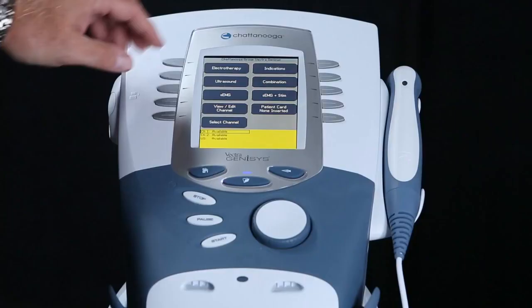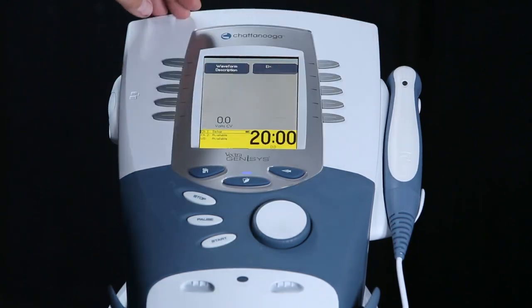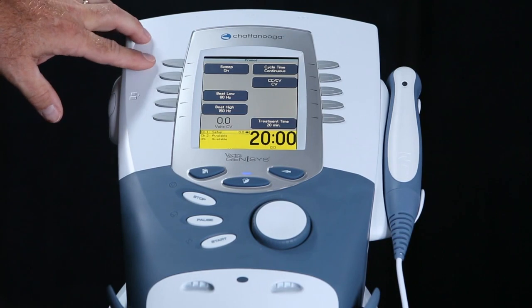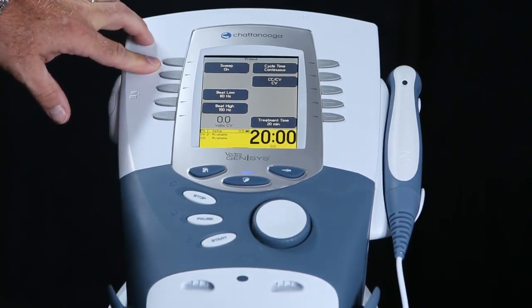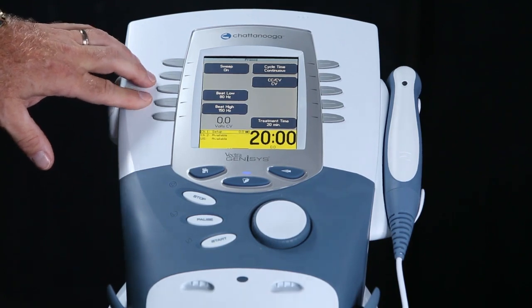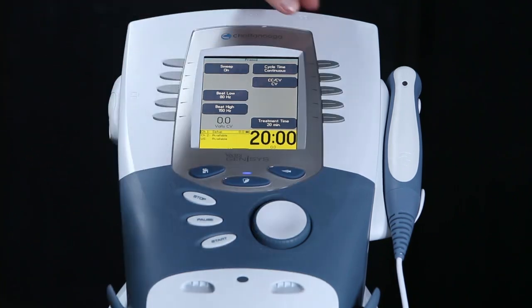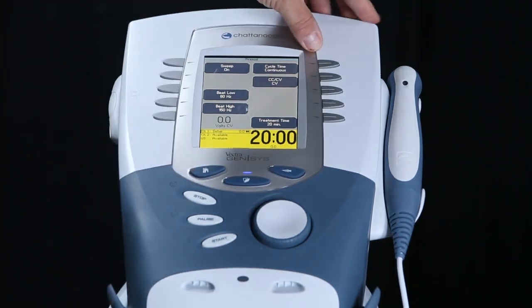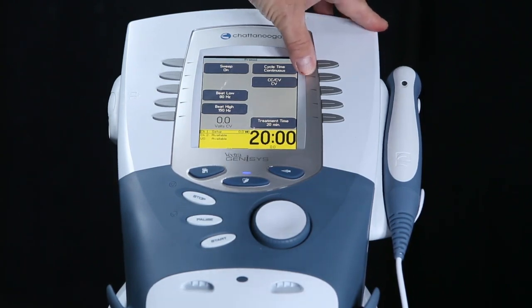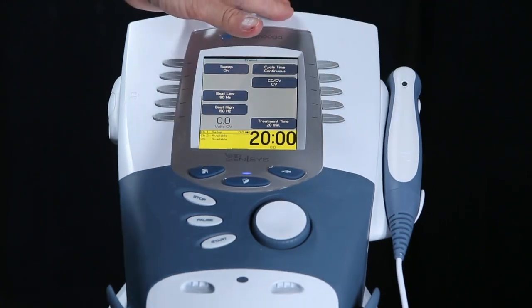Now let's press the electrotherapy key, then we'll press the Premod key, then we'll press the edit key to change our parameters. The first parameter, sweep, is set on, that's where we want it to be. Our frequency is set at 80 and 150. We'll leave that there since we're going to use a gate theory protocol to treat this knee pain. The cycle time will be continuous and will be set on constant voltage. Since it is continuous, that will create a more comfortable treatment for our patient. Our treatment time is now 20 minutes.